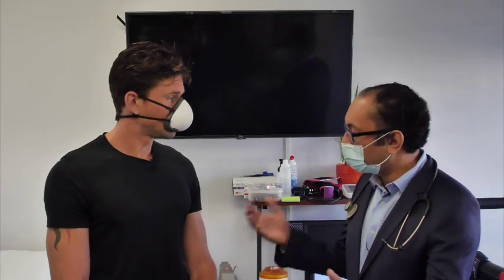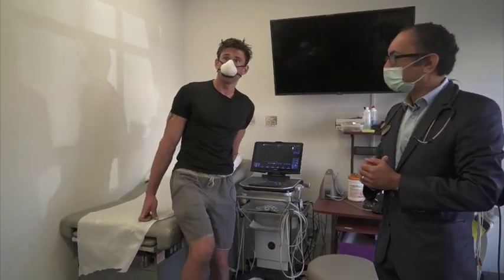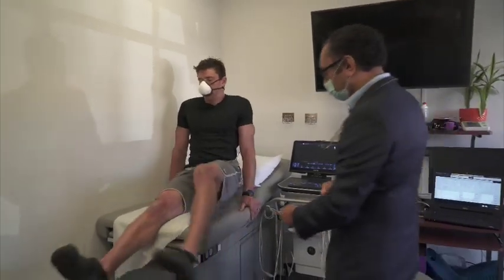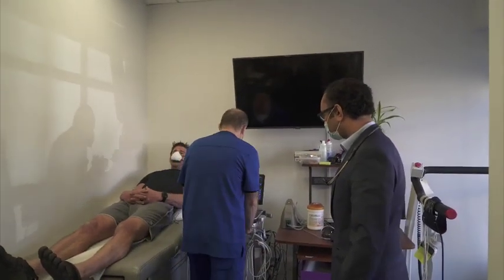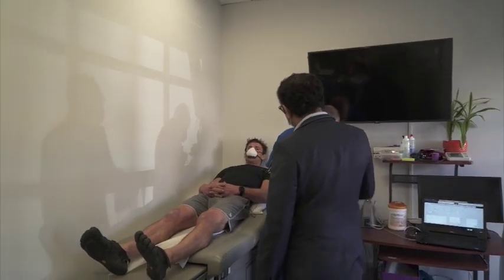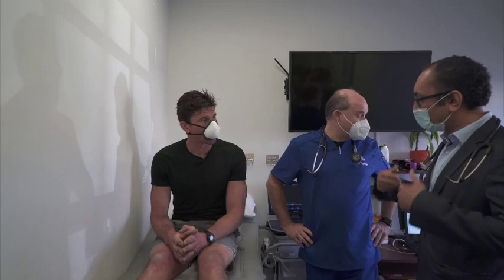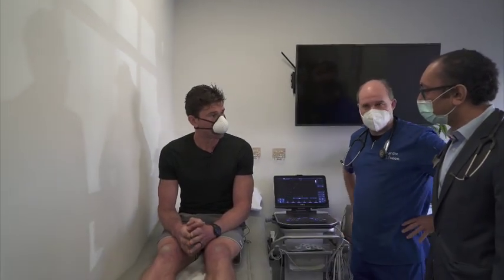We're going to get started with your ultrasound. This is going to be imaging of the actual musculature — ultrasound imaging of your heart muscle. We're also going to look at your carotid arteries, which is a great place to visualize the buildup of atherosclerotic plaque. And then we'll also take a look at your abdominal aorta, and your arteries in the lower legs.